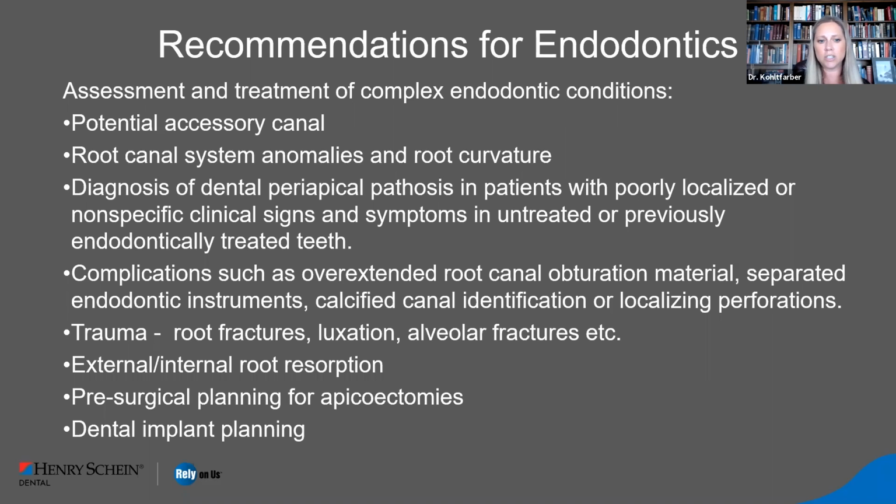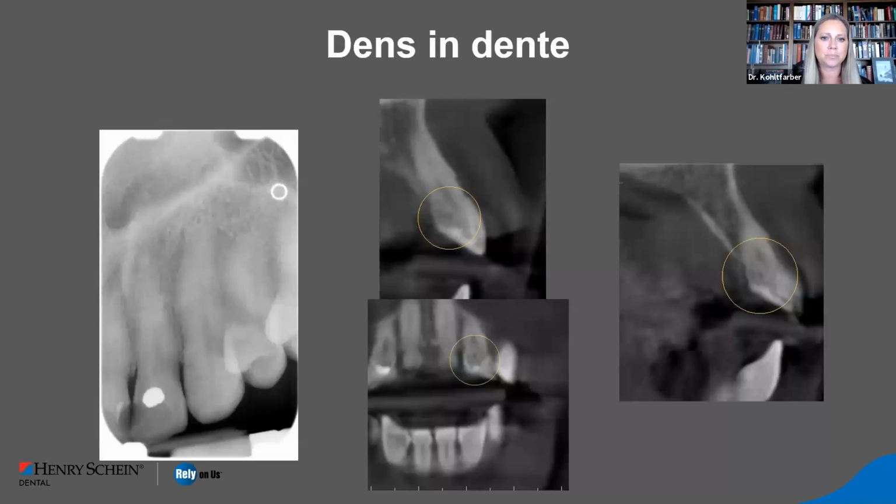And definitely you can justify. These are all reasons to justify taking a CBCT. So let's look at some examples. They weren't entirely sure what was going on with this little tooth here. This is our 2D. And in 3D, you can see the dens invaginatus much better.